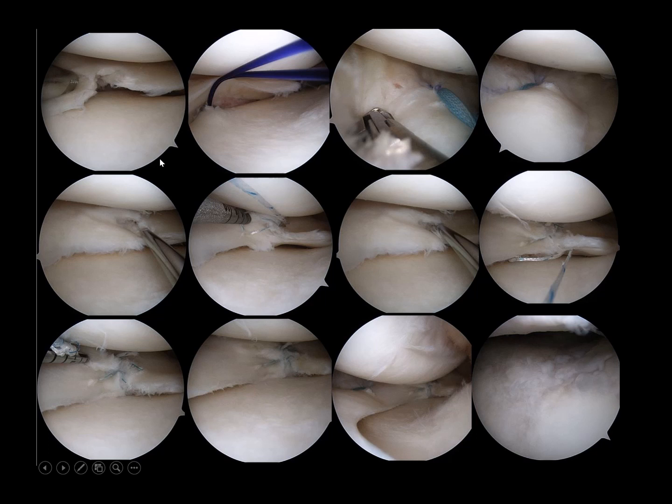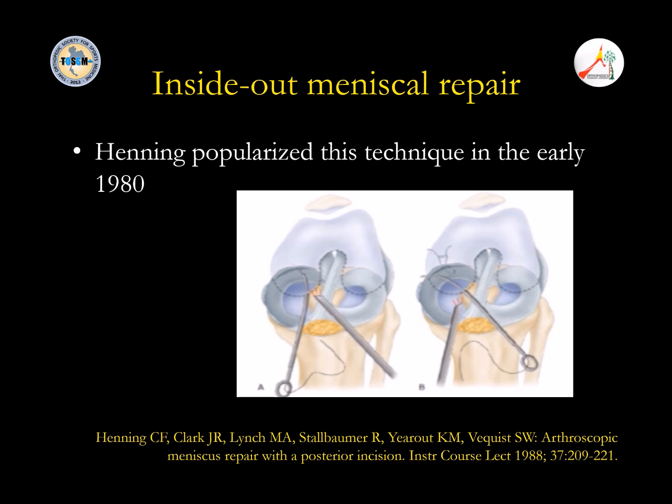We tried reduction. We had the extrusion already, so we reduced the meniscus back using extrusion reduction. Finally, this is a picture of his meniscus. Now he's quite active. He keeps getting young again. But he just told me that he had pain on the opposite side, five days ago, on the right knee. The left knee is okay now.